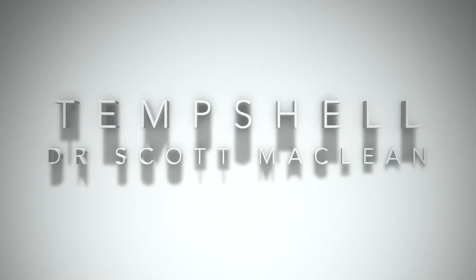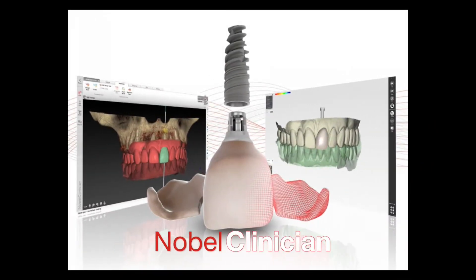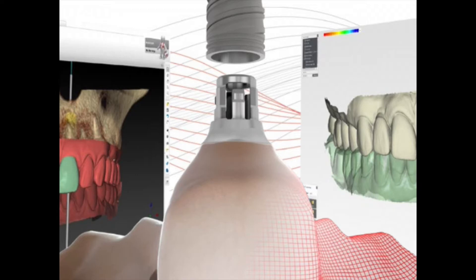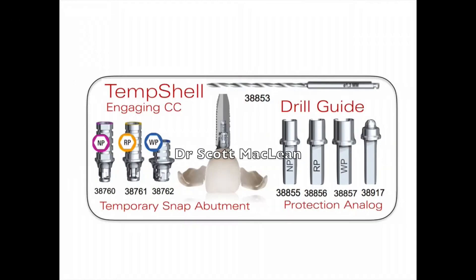Today's case we're going to be showing a temshell. The temshell is an immediate temporary that is made on a guided implant. During my courses I'll show the guided surgery, but here we're showing what the Nobel Clinician software will do — allow you to fabricate this temshell. I'll put a request into the dental lab after I've planned my implant placement and ask them to build the temshell and have it sit on the adjacent teeth.